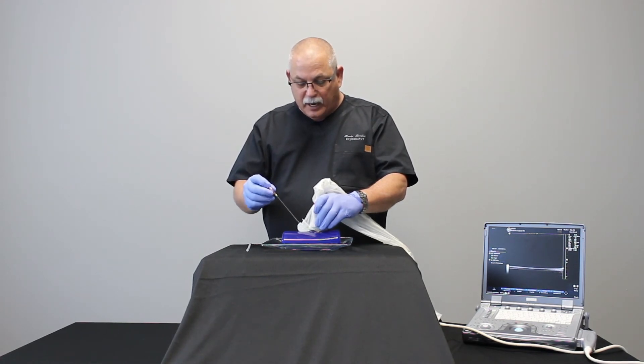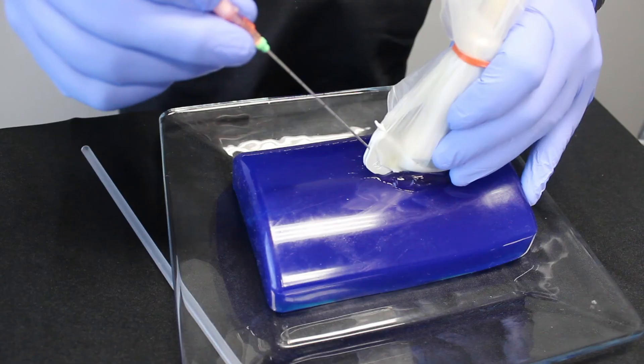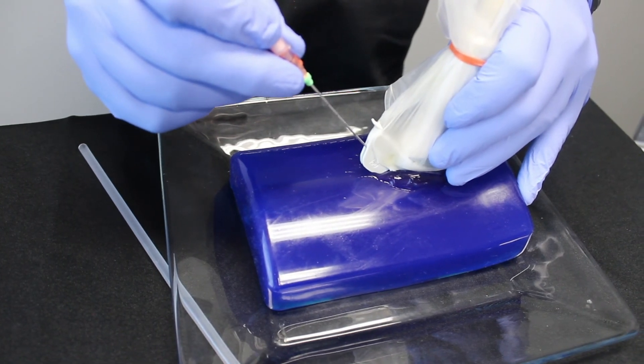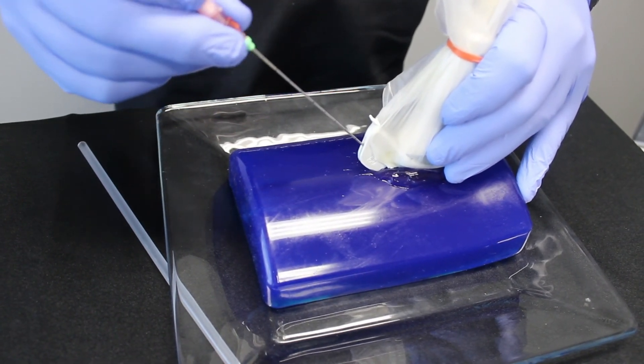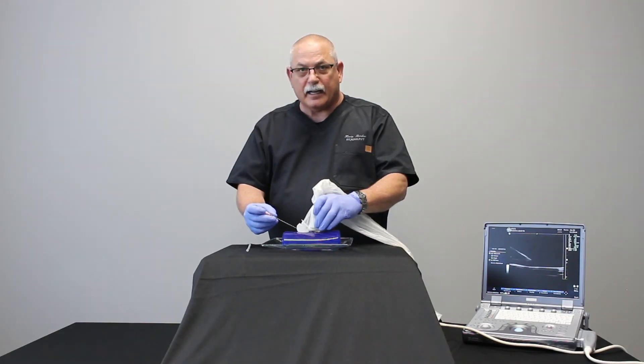The beauty of this guide is that if during the procedure I see that I don't like the angle I'm currently going at, I can withdraw the needle slightly and change my angle. I can do that repeatedly as often as I feel I need to.